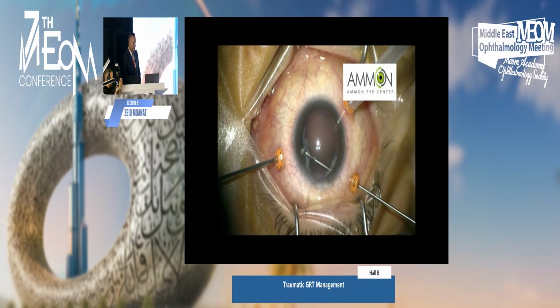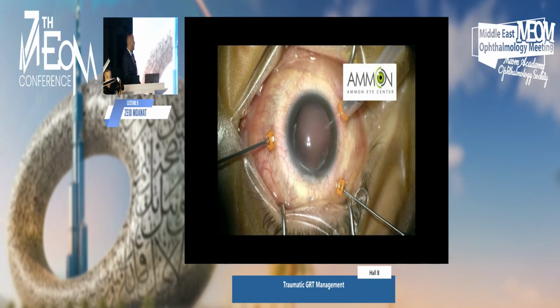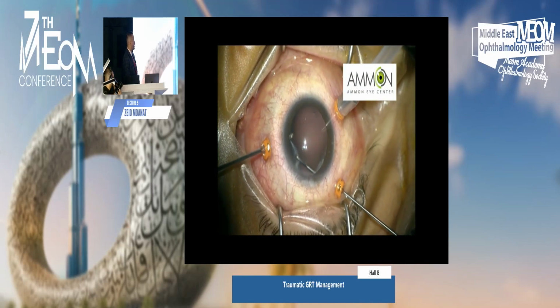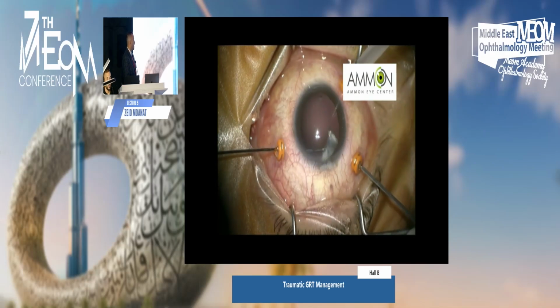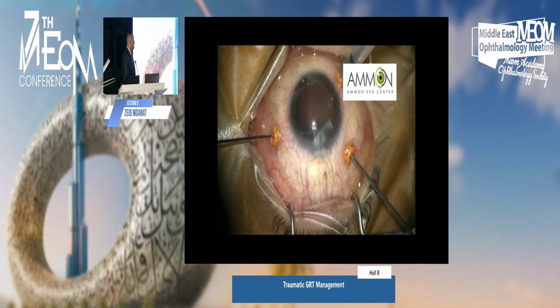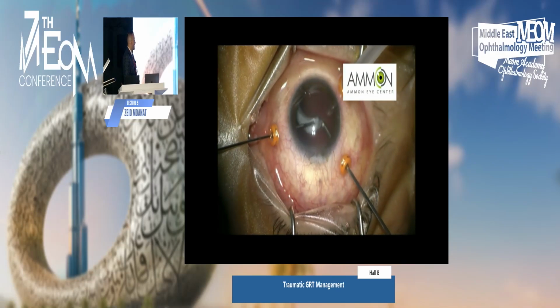Now I'm removing the remnant of the fibrotic capsule carefully with a pair of forceps and just cutting the zonules rather than just ripping it off to avoid further damage. And as you can see, I'm successful in removing this fibrotic capsule carefully.